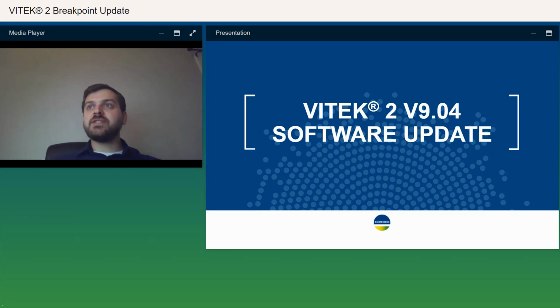And then in Q2, which is now, we are preparing to launch this software VITEK V9.04. So again, this version is needed in order to support the new cards that we'll be rolling out later this year, making sure that you can report out these new drug formulations and new antimicrobials with the new lower breakpoints.